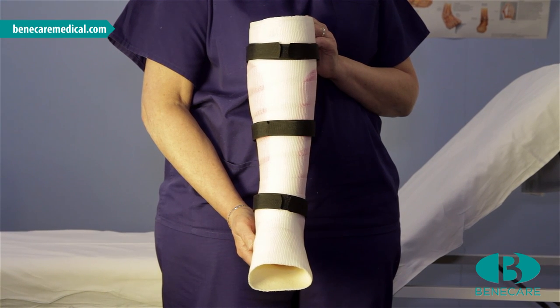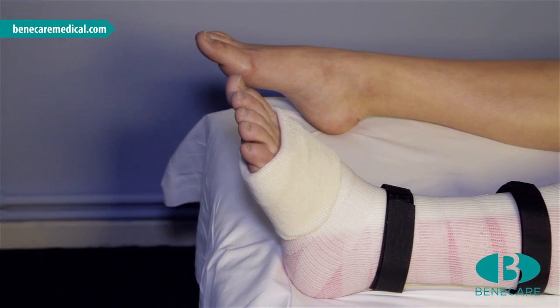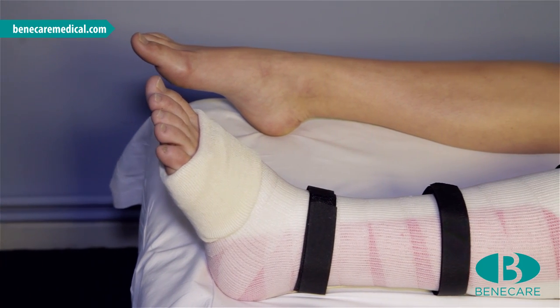Today we are going to apply a below-knee combi-cast. It can be used for all ankle injuries including Weber fractures and lateral ligament ruptures.